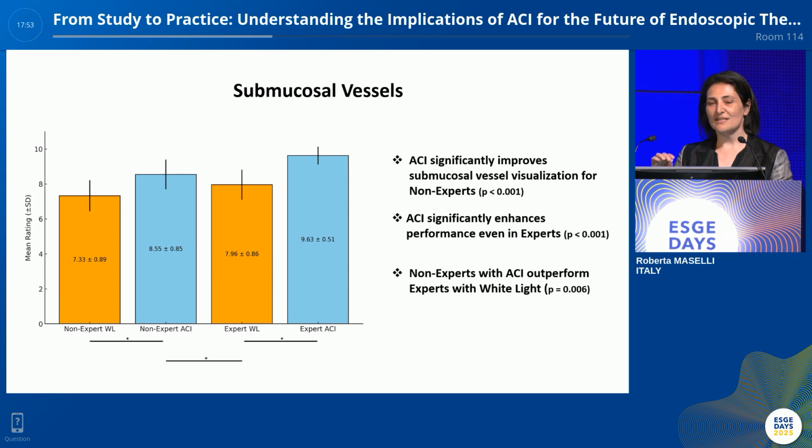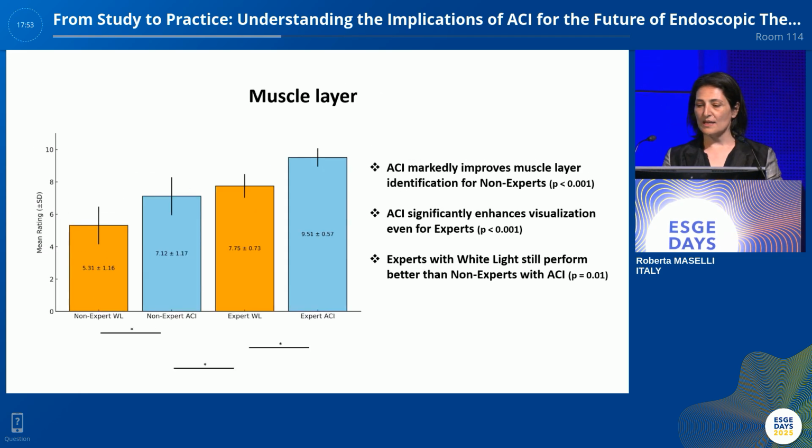So this is important also for training. If we let our trainees be safer and have a technology that allows you to recognize the vessels, it means to change the outcome of the patient. Is it true only for submucosal layers? Let's focus on muscle layer.